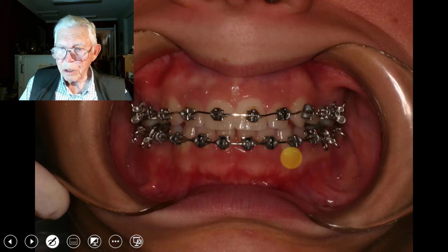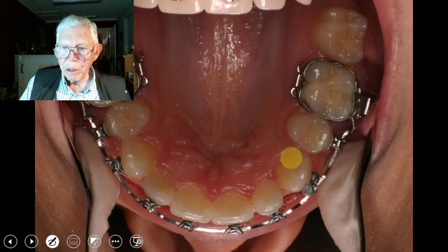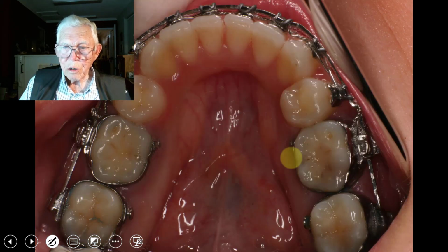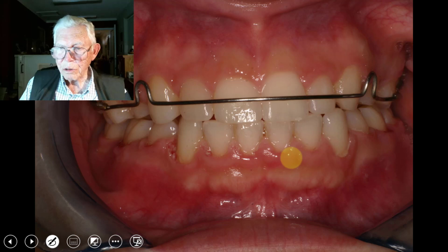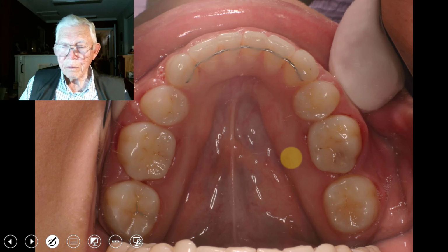This is 06, and let me go through. We are finishing taking the teeth out, taking the braces off and closing the space of the teeth. And here the finishing touches on closing it up. That's 07. And this is, I think, 06 or 07. She's in a retainer, and we close back like that. And we have a good class 1 relationship.